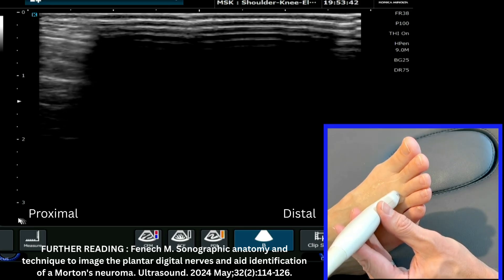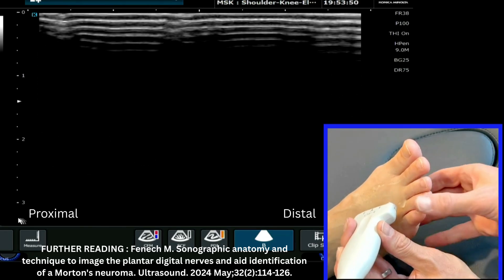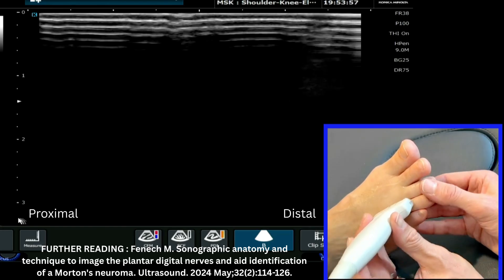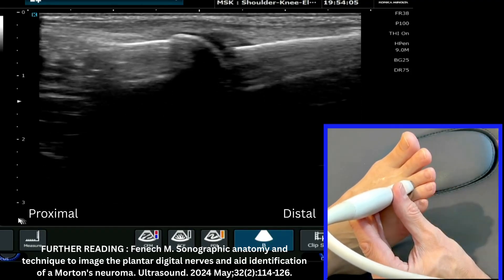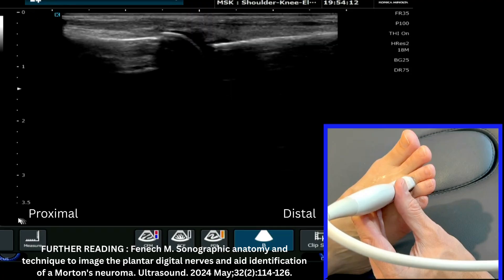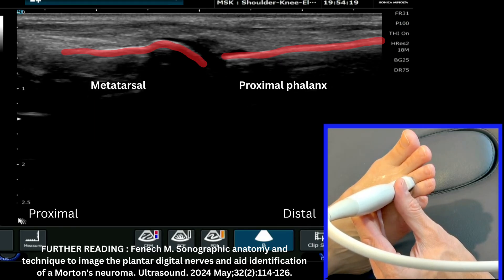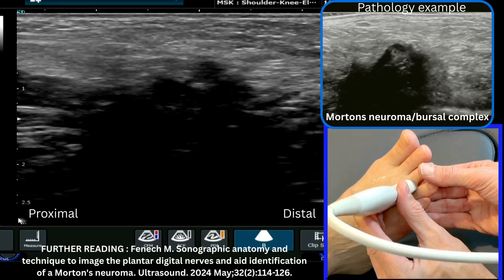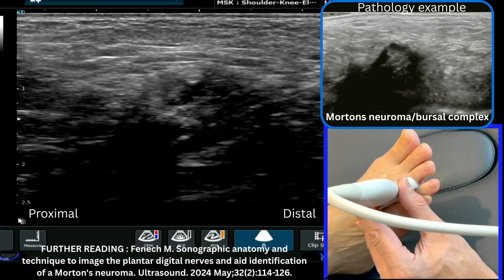We've seen how to look at the dorsal aspect of the webspace with the foot flexed. We're now going to look with the foot less supported, which enables us to dynamically affect the image. We'll do the same scan again — dorsal aspect of the metatarsophalangeal joint — with my frequency at nine for good penetration. I'll reduce my depth slightly, but not too far, as I'll need sufficient depth when transitioning into the webspace. I'm now rolling the probe into the third-fourth webspace, which shows the challenges of highlighting this condition.